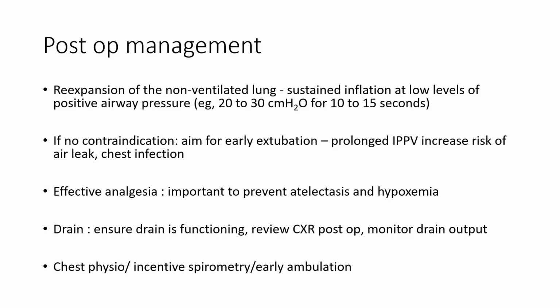Initially, we clamp the dependent lung first and unclamp the non-dependent lung. Then we apply the CPAP and look directly for lung expansion. Okay. After that, we can ventilate both lungs.